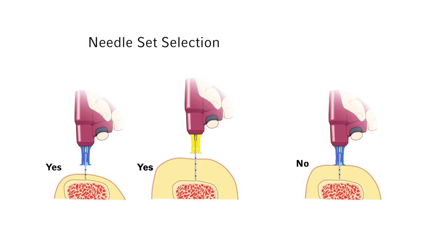If the needle set is inserted through the soft tissue and does not reach the bone, or the 5 mm mark is not visible above the skin with the tip of the needle set touching the bone, the needle set is too short. A longer needle set or alternate site should be chosen prior to penetration of the bone cortex.